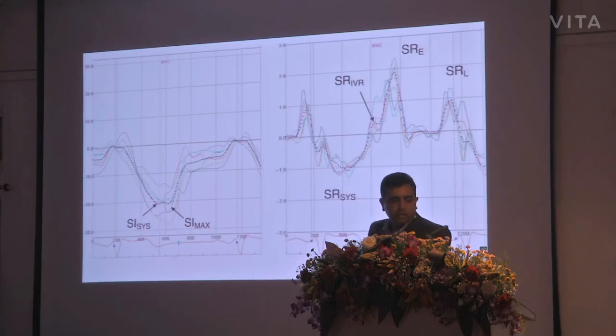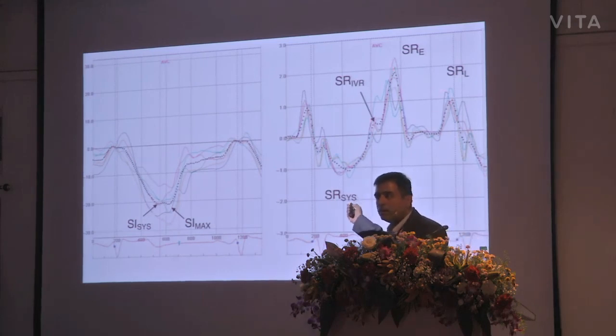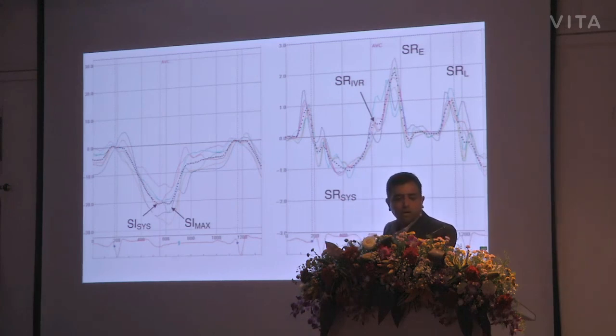your maximal strain. You have systolic strain rate, IVR strain rate, E strain rate, and late strain rate. So these are different measures you can make on the strain and strain rate curves.